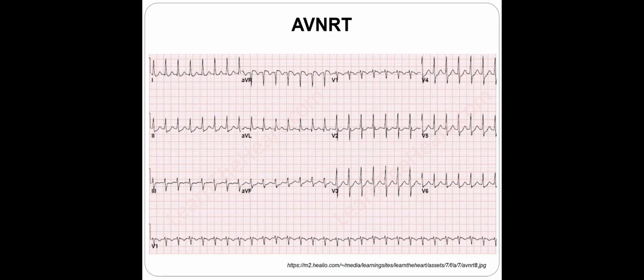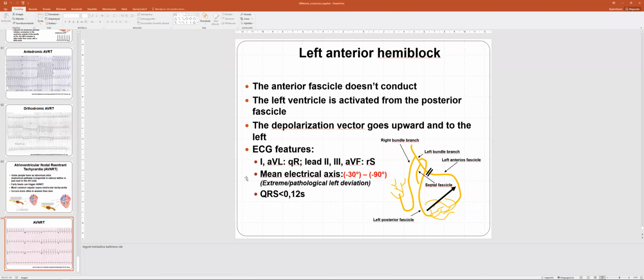To diagnose an AVRT tachycardia, at rest the patient will have WPW syndrome. This is how you would diagnose it very easily because you see the sign of the delta wave and the short PR, and after that the tachycardia develops, that's an AVRT tachycardia. Okay, so any questions?